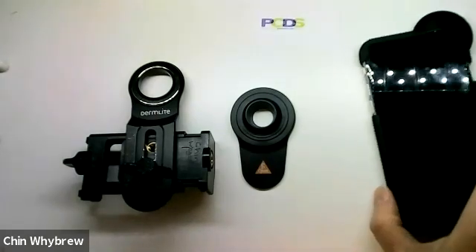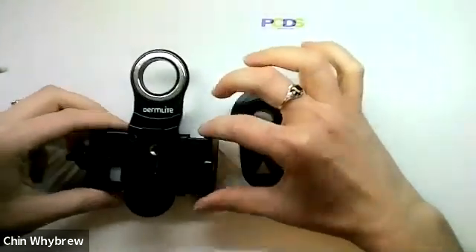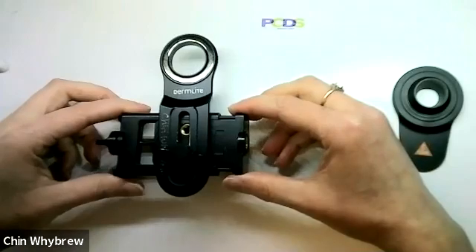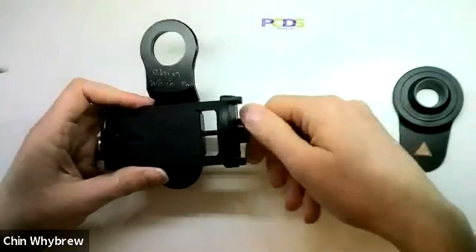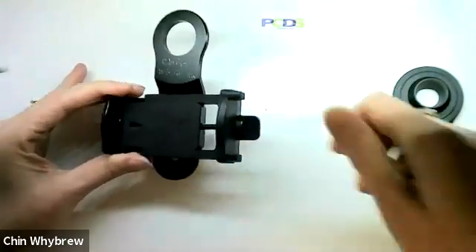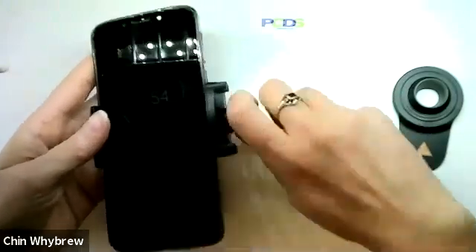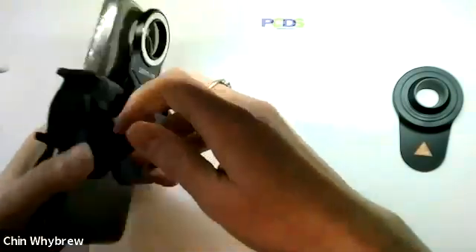However, if you are working in a practice where you want to share a dermatoscope and use it with multiple different cameras, then this is the Dermalite universal phone adapter. The way this works is it has a cradle here that you can open up to make it larger and close to make it smaller. You just put the phone into the cradle like that and tighten it up, and this will fit multiple different phones.